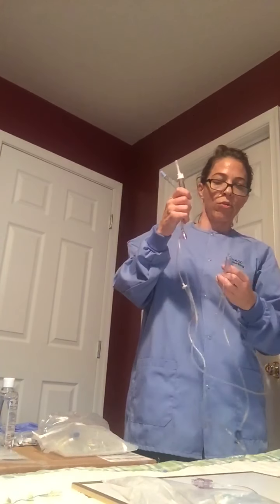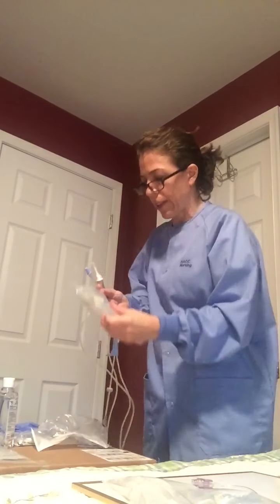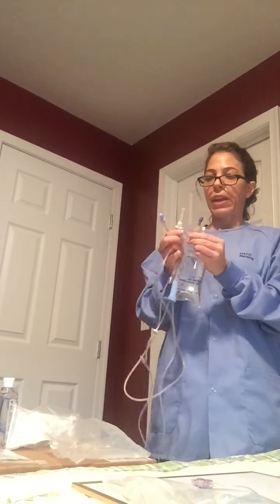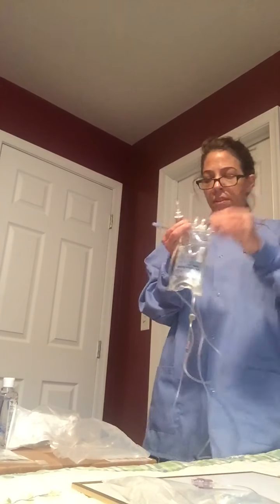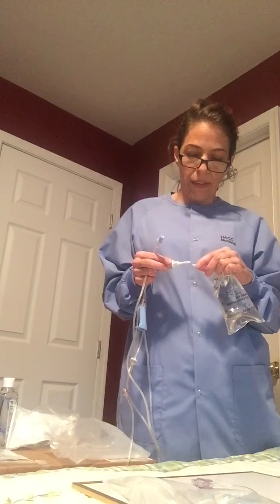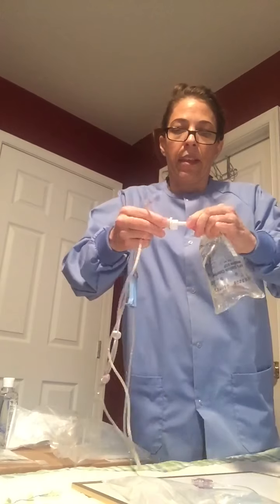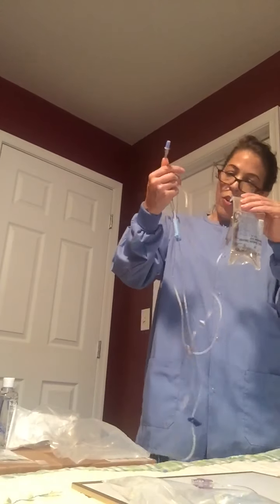I'm going to close the roller clip, and I'm going to get my IV medication out as well. When you spike the IV medication, this portion needs to be sterile. So I take off the spike cover, and I take the plug out of that area. If you can see, I'm going to steady my hands. I put that in and twist it to that little notch on the drip chamber there. So my roller clip is on.